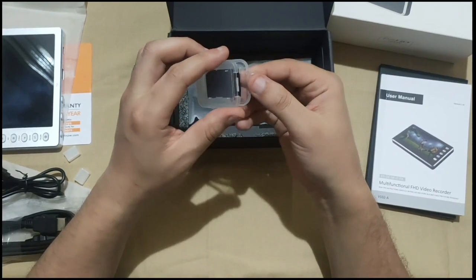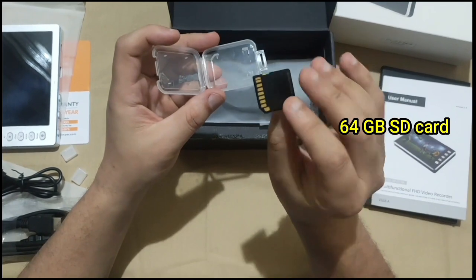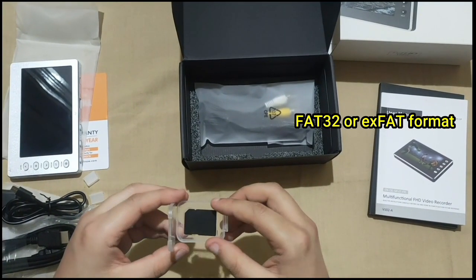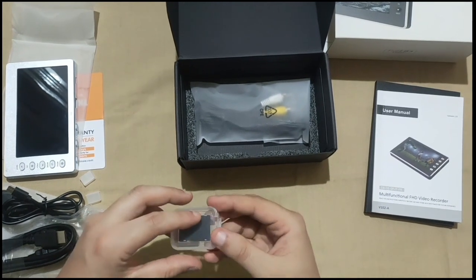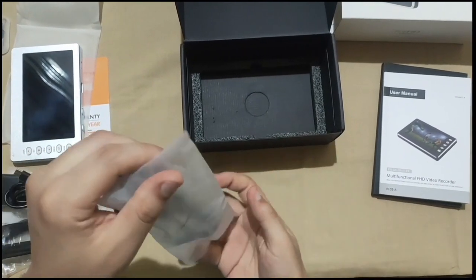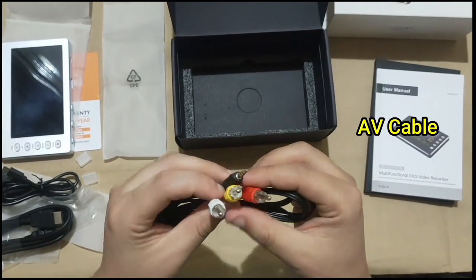This capture device comes with a 64GB SD card. You can use SD card with a maximum capacity of 128 gigabytes for saving. Make sure that SD card is formatted as FAT32 or exFAT format. SD cards with speed class 10 or higher are recommended. This is AV cable for input and output.